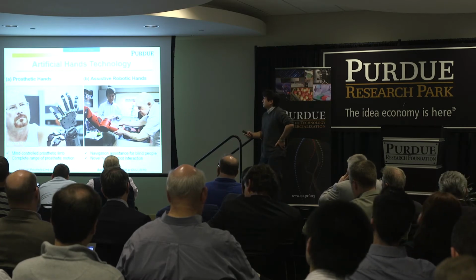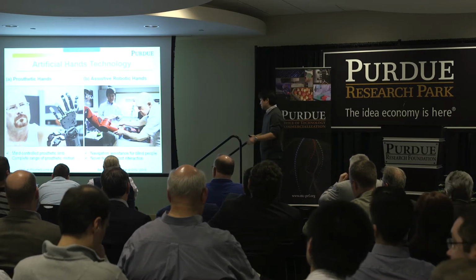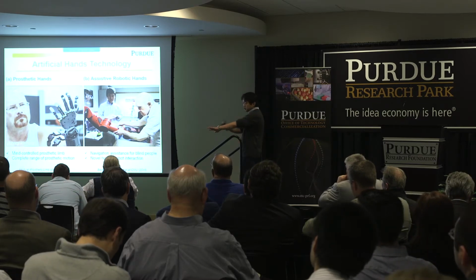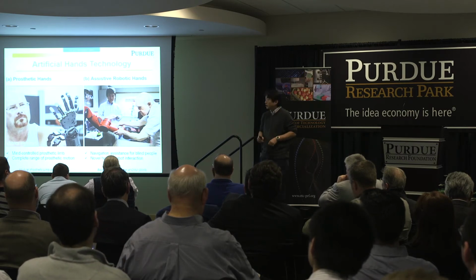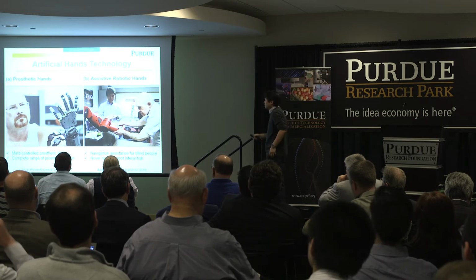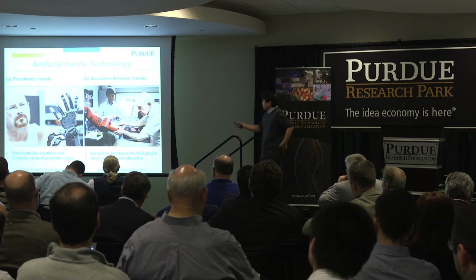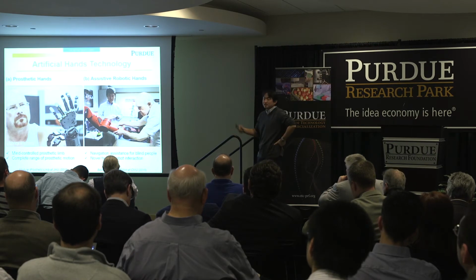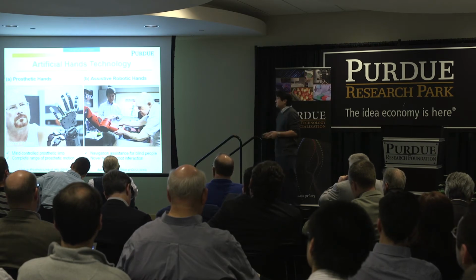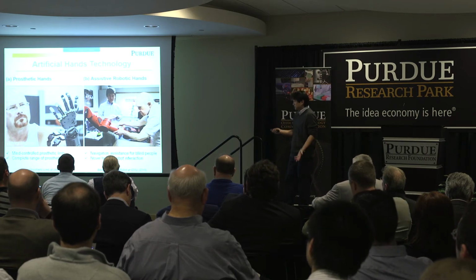As an example of a gold standard system for each category, on your left side, you are watching the first human being who has been attached to mind-controlled prosthetic arms with a complete range of motion. On your right side, you are watching the image of an assistive robot named Baxter. This is for navigation assistance for blind people, especially in airports or bus stations. Obviously, these are very important and valuable technologies for those people who need help.